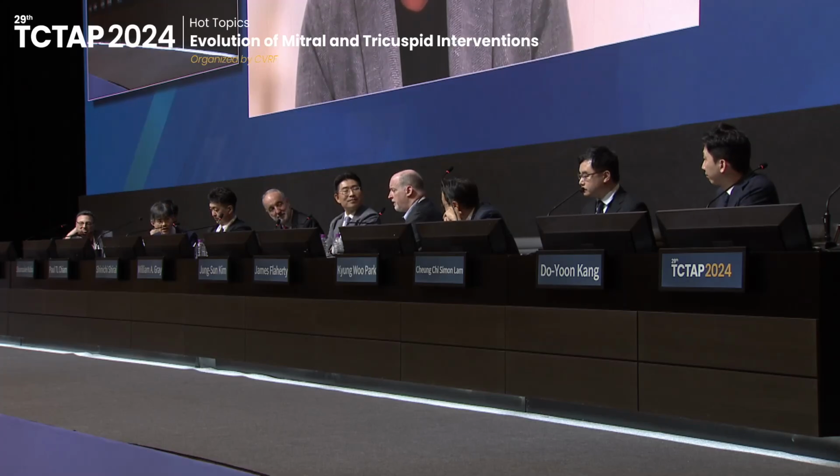What do you think? Well, Susheel has mentioned that these patients generally require lifelong anticoagulation. So that's an issue. And David could tell you that anatomy really matters more so for TEER. So if you have poor TEER anatomy and you can tolerate anticoagulation, that might lean you towards valve replacement. Susheel? We'll take a quick poll here.